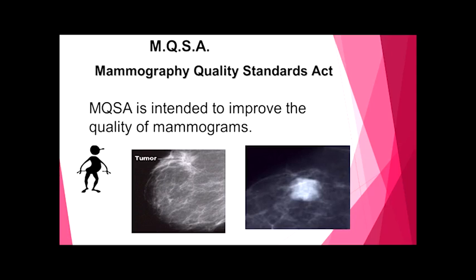And so we know that the things that are in place for mammography and the standards that have been set have improved the quality of the procedure and ultimately improved the quality of the interpretation, which translates to an improved quality of care for our patients.